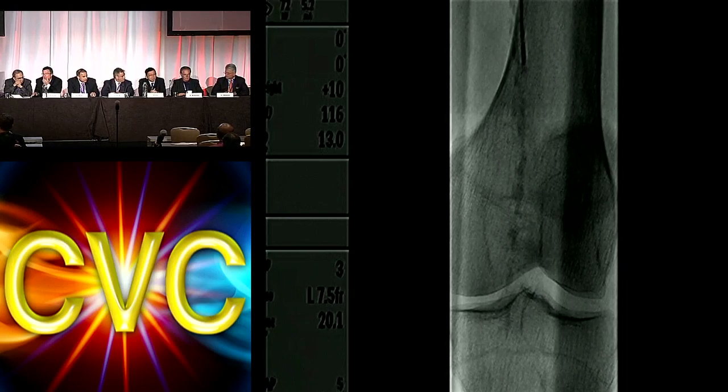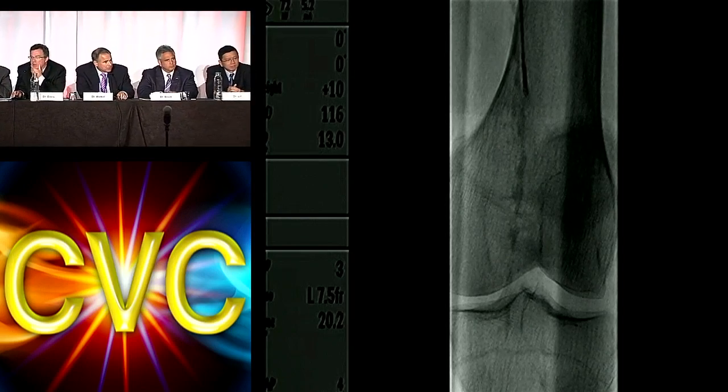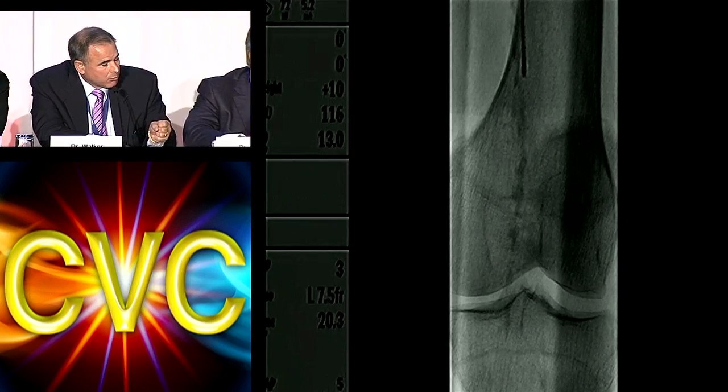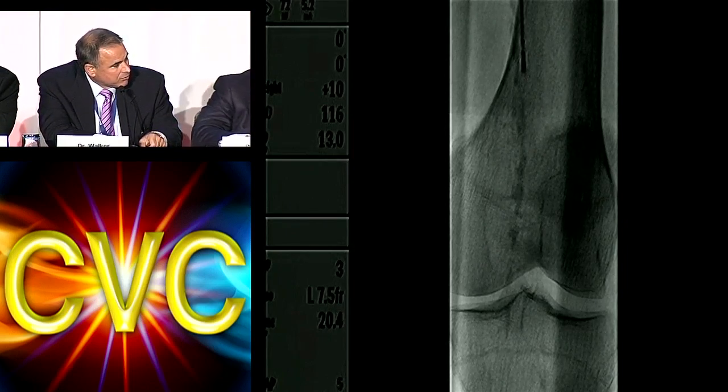Victory 30-gram tip with an 18 thousandths support catheter. I think it will get you through this, and I think with this much calcium, you can potentially see where to steer. They've been through here before. More likely than not, there's a stricture there from the healing, and I think you'll get through it.